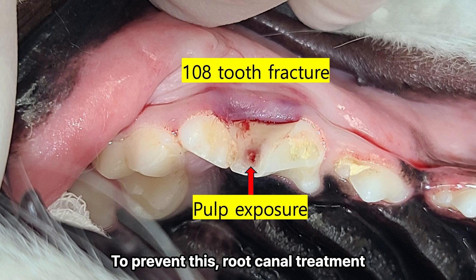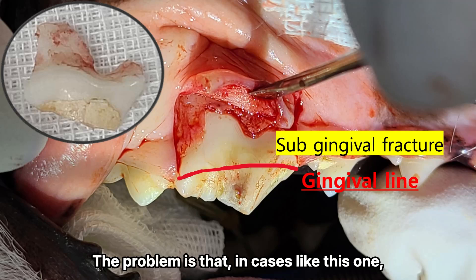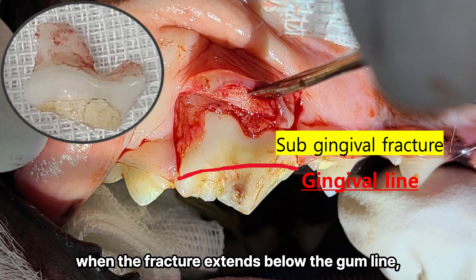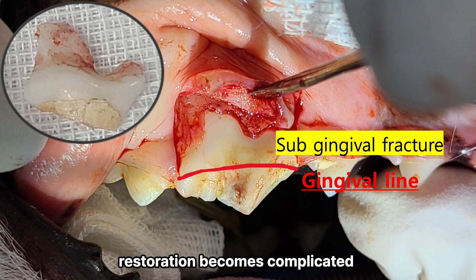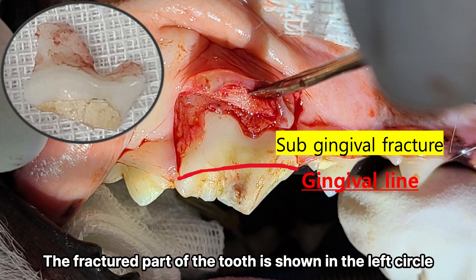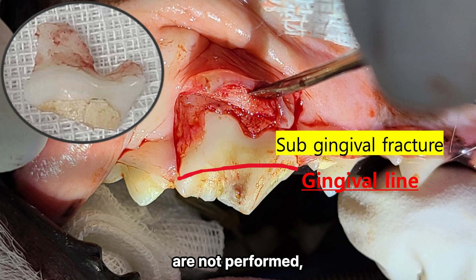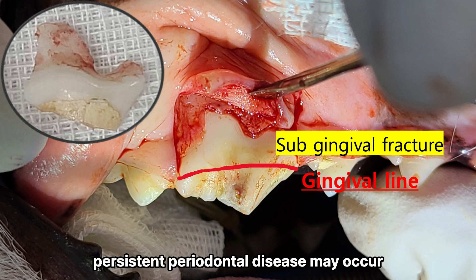To prevent this, root canal treatment is necessary. The problem is that in cases like this one, when the fracture extends below the gum line, restoration becomes complicated. The fractured part of the tooth is shown in the left circle. In such cases, if proper gingival tissue and tooth restoration are not performed, persistent periodontal disease may occur.